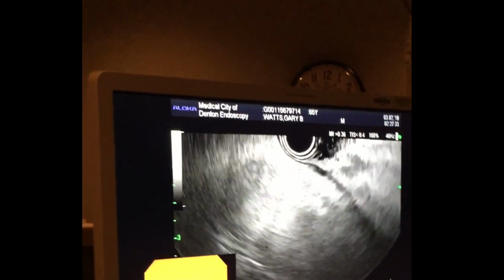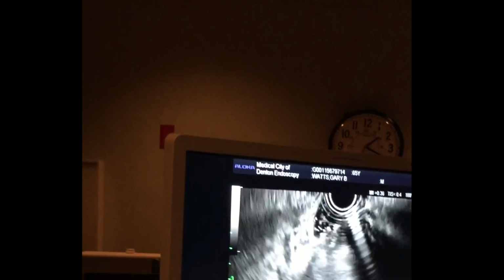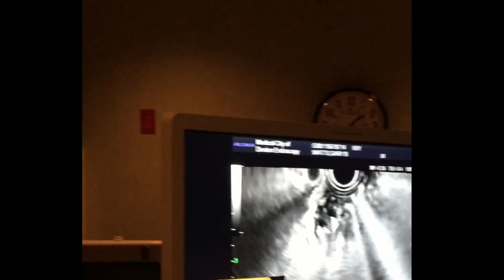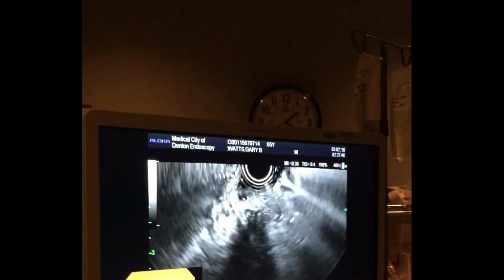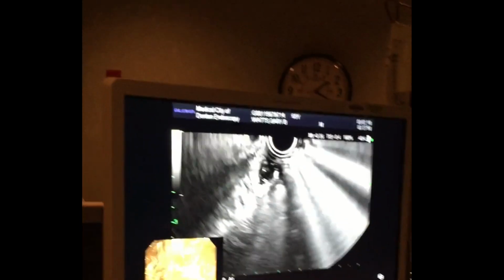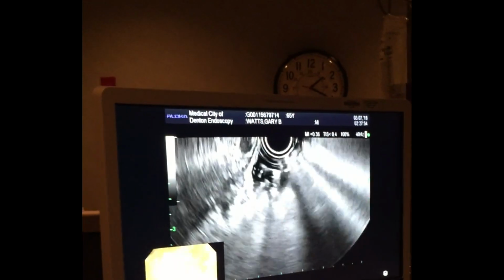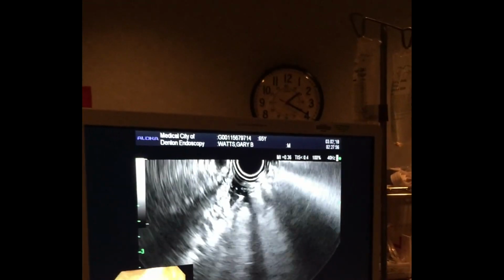Once again, on the screen is the fluid next to the EUS transducer, which is a testament that the fluid is gushing out of the pancreatic pseudocyst into the gastric lumen. I had this patient under general anesthesia and intubated for airway protection.